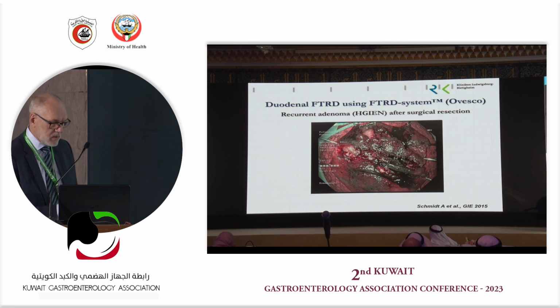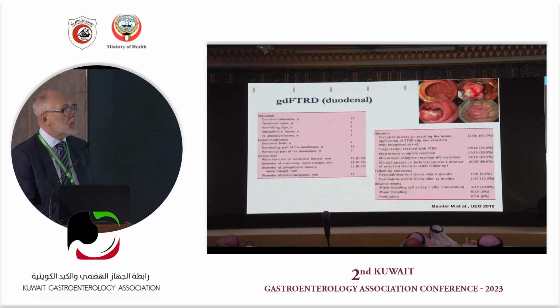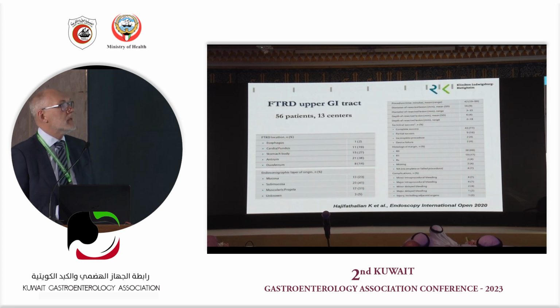We resected the recurrent adenoma that was not lifting, no chance to do it with EMR or ESD. And we published our data also a couple of years ago. There's not much publication on this issue. 20 patients published from our group, 13 adenomas, technical success rate 85%, because you cannot always pass the pylorus, this is a minor problem. The results are a little bit not as good as in the colon, but quite reasonable, and complications mostly minor bleedings.